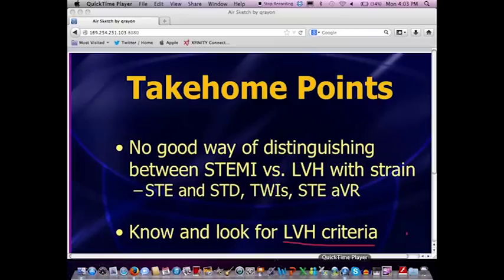So when you have a patient coming in with concerning symptoms and you see that there's LVH present, best thing to do, get old EKGs, get serial EKGs, get on the phone with cardiology, get them to weigh in as well. But if you see horizontal ST depression or symmetric T waves, you cannot simply attribute that to just LVH with strain. So there's a couple clues.